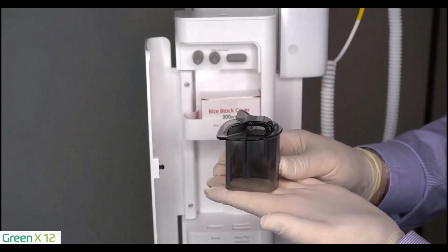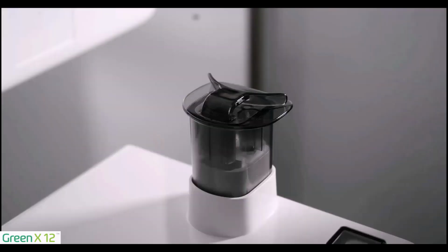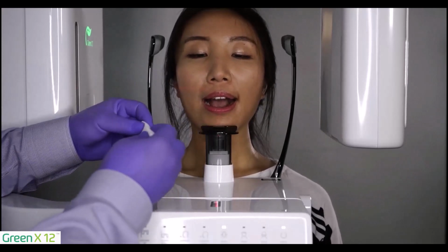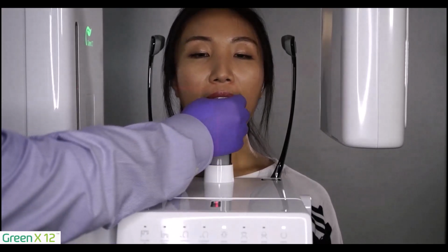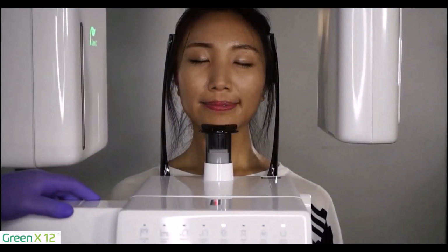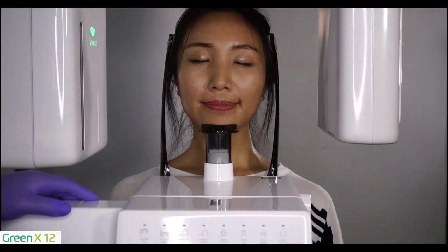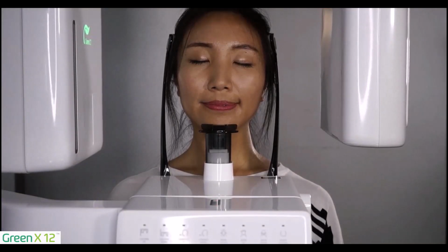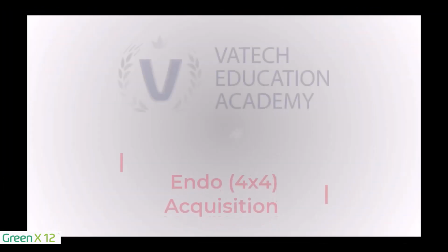Special bite B or edentulous rest. Additionally, use a cotton roll to separate the bite. Note, this method may also be used if the clinical need requires the patient to be in centric occlusion, having the patient resting with the chin cup with the bite at rest.